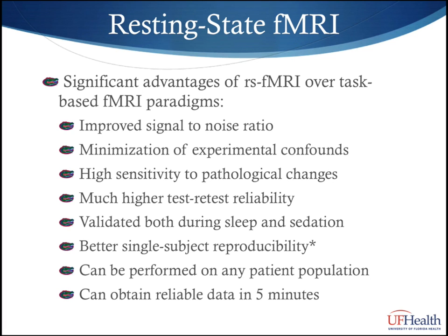It is also well known to show high sensitivity to pathologic changes, perhaps even more reproducible than task-based studies. There is also a much higher test-retest reliability. It has also been validated both during sleep and sedation, which makes it particularly powerful, in particular with neonates. There is also a better single-subject reproducibility.